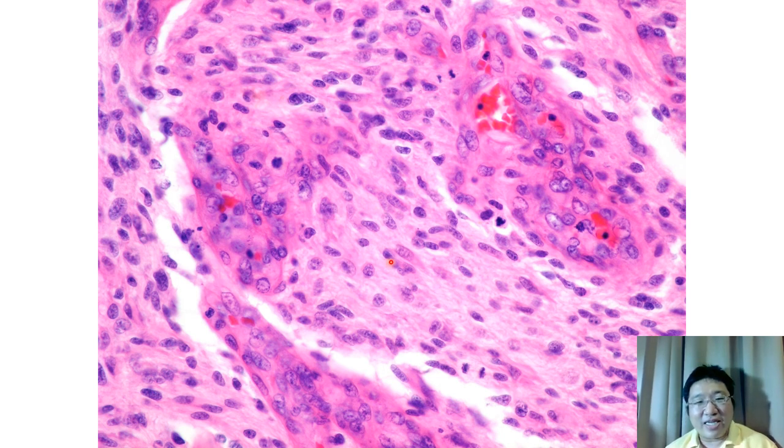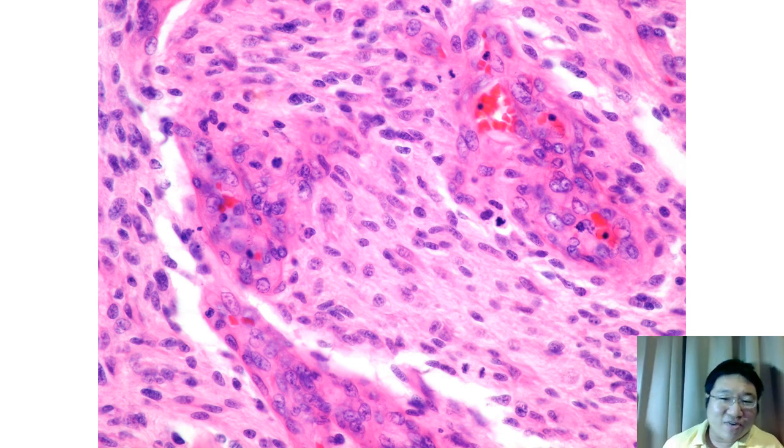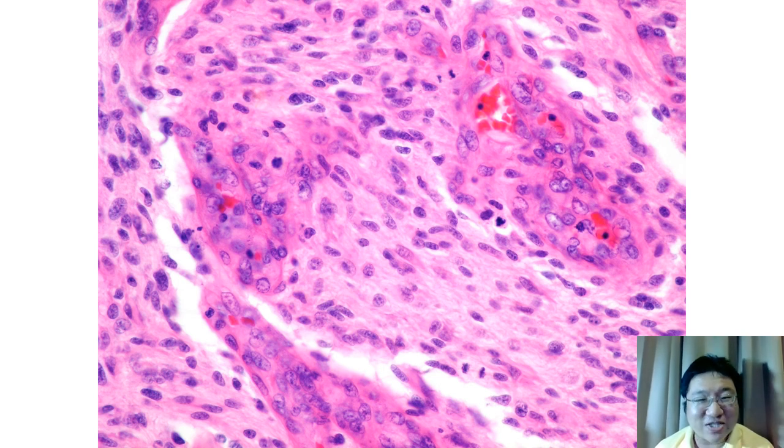And then we have the other criterion, which is mitosis. Normally, astrocytes are stable cells. They are not expected to divide in normal condition. And here we see that these cells are abnormal and there are increased mitotic figures. Here is one, here, oh, so many mitotic figures. So have we seen all the four criteria for making the diagnosis of glioblastoma? Yes, so this one is glioblastoma WHO grade 4. We see A, atypia or anaplasia, M, mitosis, E, vascular endothelial proliferation, N, necrosis, fulfilling the criteria for making the diagnosis of glioblastoma.